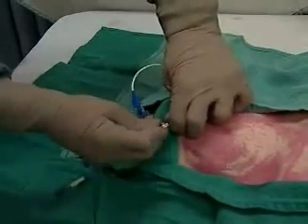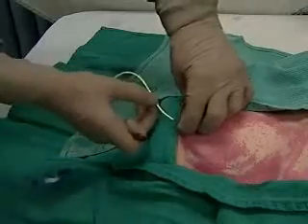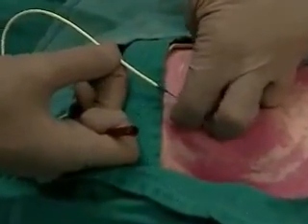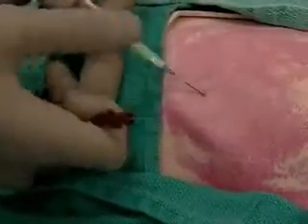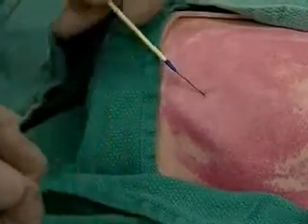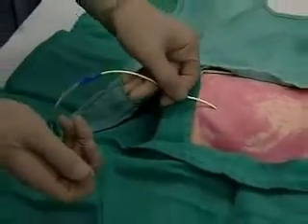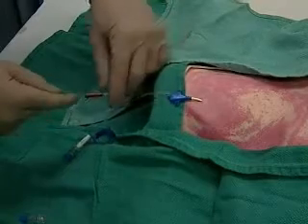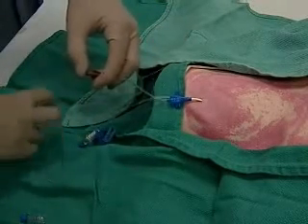Uncapping that hub, we'll advance the wire backwards, till it exits the port. Grab it and advance the catheter through the skin. Then remove the wire, getting ready to cap the port with your finger and put the hub back on.